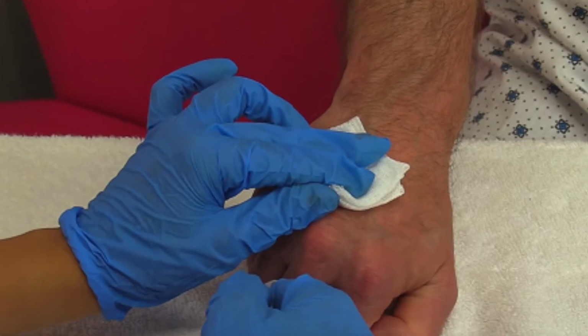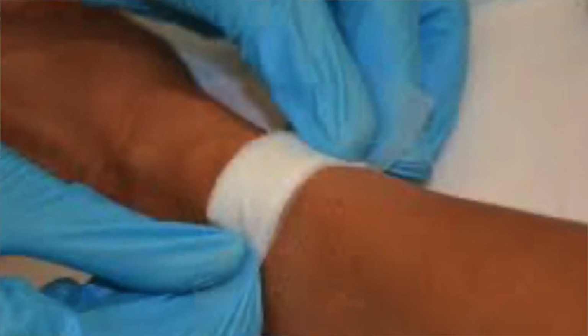Then when you are removing the arterial line, wait for a single drop of blood to come out of the arterial line site in order to avoid pushing a blood clot into the vessels that can cause thrombosis. And also, once you remove the arterial line, apply pressure till bleeding stops. Once the bleeding stops, put a tight dressing over it, and the dressing stays there for 24 hours.